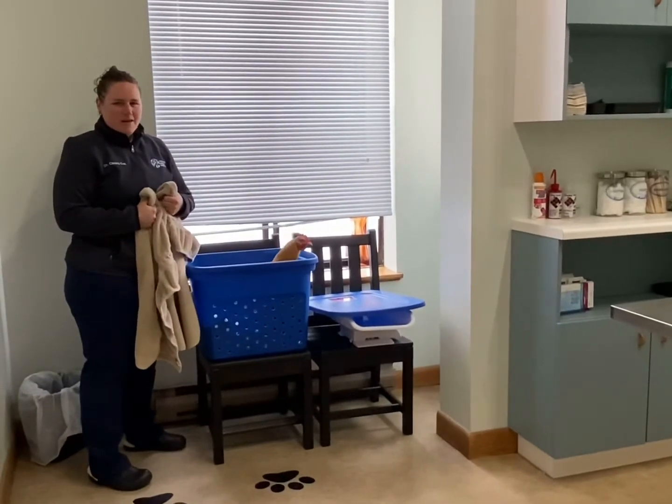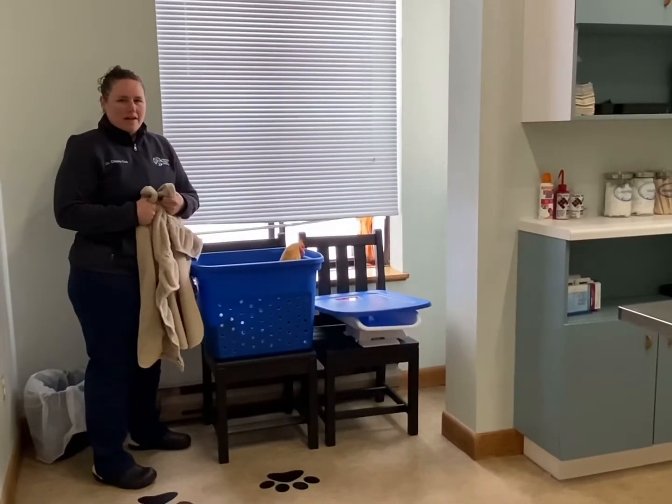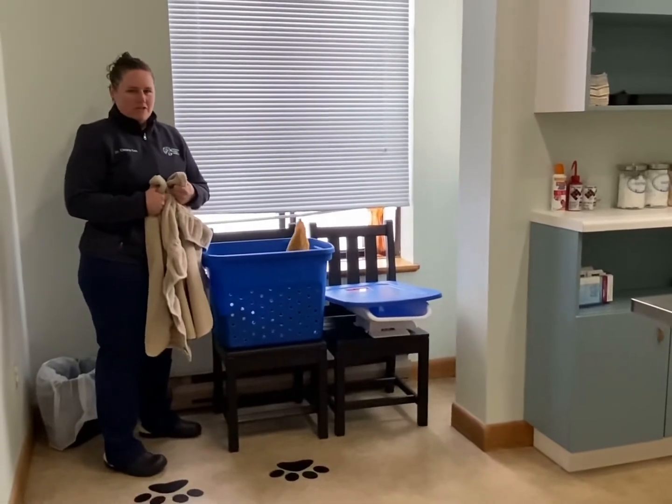Hi, this is Dr. Cox at Littleton Animal Hospital. Today we're going to show a video on how to medicate your chicken with an intramuscular injection.